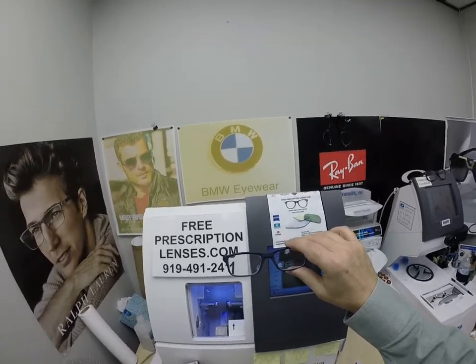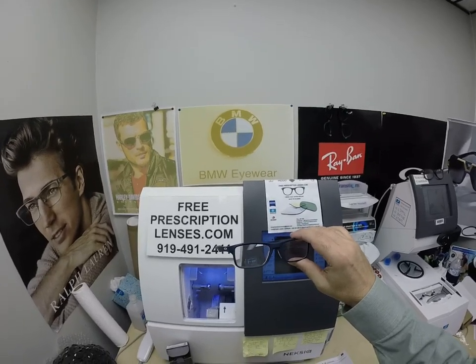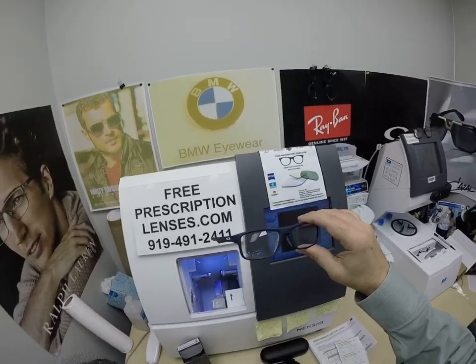Just be patient, Keith. It takes a few days. Trust me, I sell a lot of these things because they work. The progressive lenses really do work.